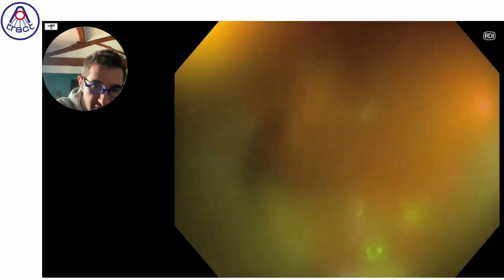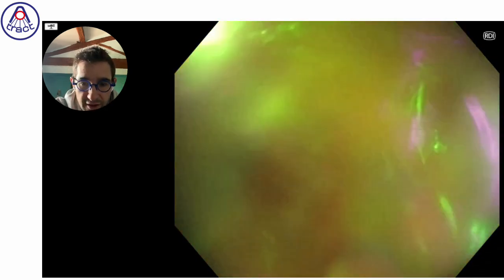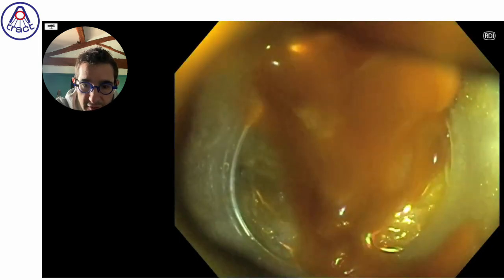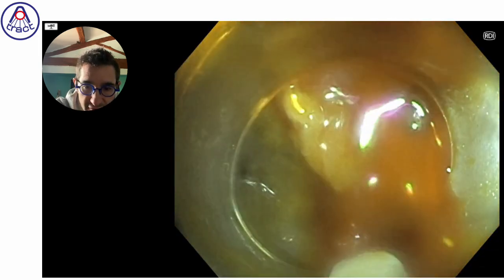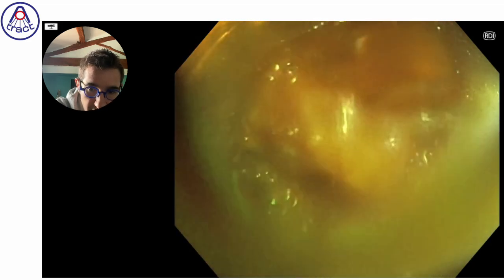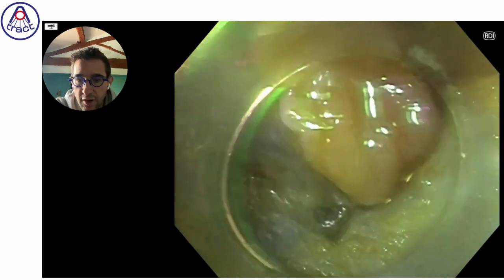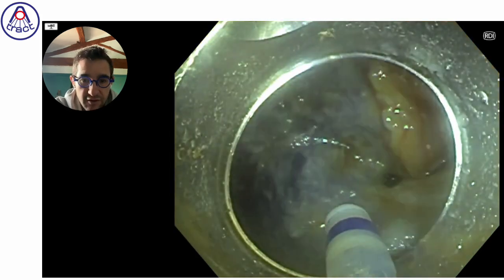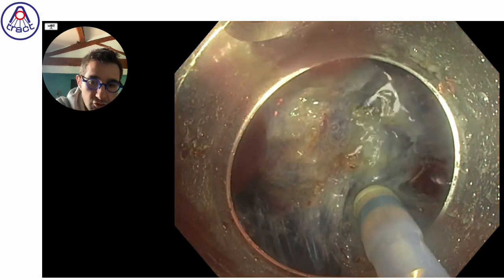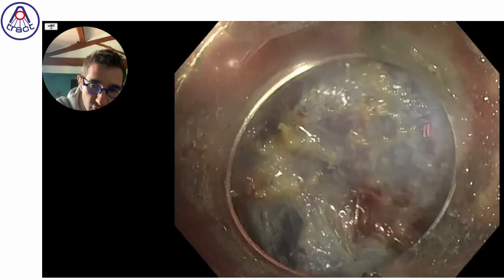So for this kind of big vessel, I really change frequently for RDI, because I'm a little less lost to see the bleeding point. And despite the fact that this vessel is relatively big with a high flow, because we can be precise thanks to this kind of coagulation mode like RDI, it's quite easy to control it without using an additional device like the forceps.